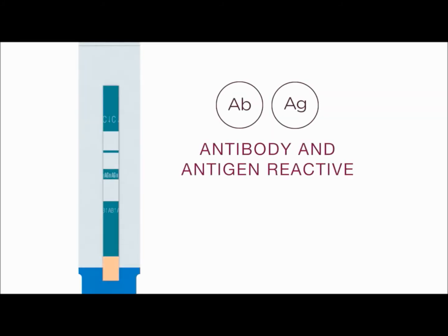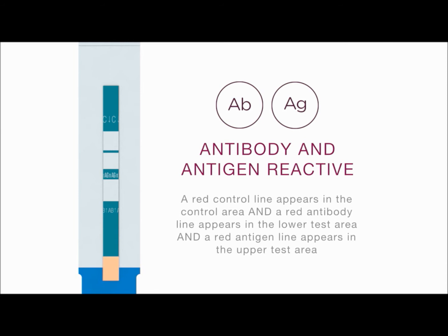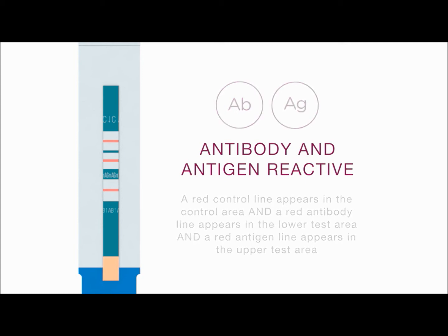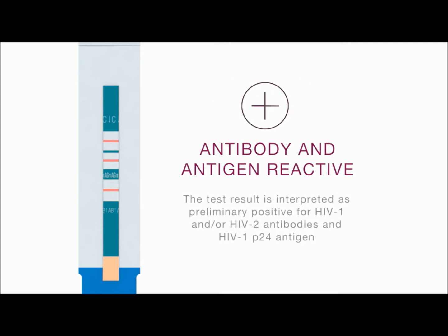Antibody and antigen reactive: a red control line appears in the control area, a red antibody line appears in the lower test area, and a red antigen line appears in the upper test area. The intensity of the antibody, antigen, and control lines may vary. Any visible red line in the control area, the lower test area, and the upper test area, regardless of intensity, is considered reactive. The test result is interpreted as preliminary positive for HIV-1 and/or HIV-2 antibodies and HIV-1 P24 antigen.